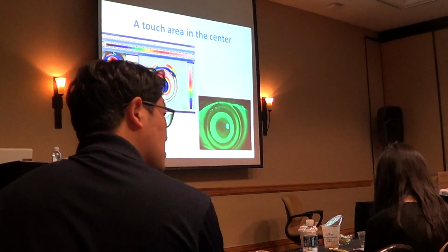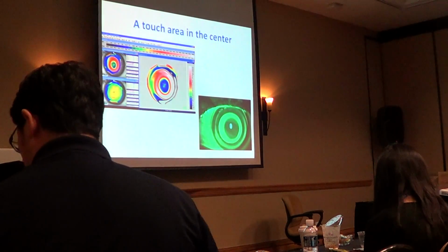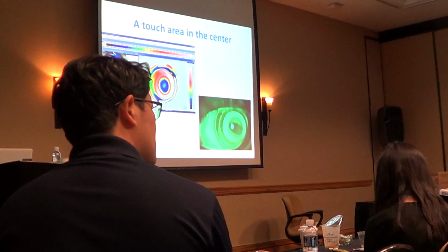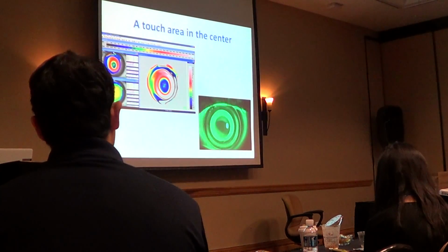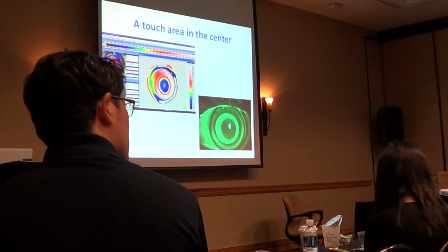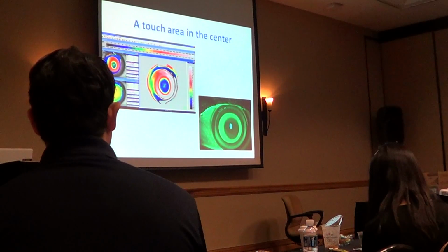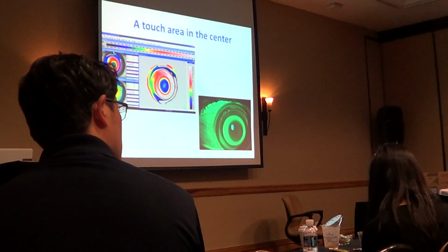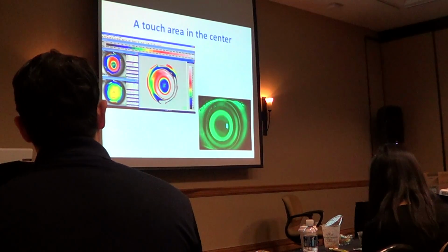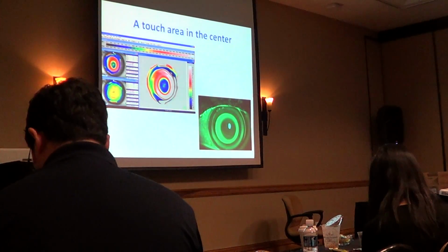Okay, if you have staining, you should change the lens. That's it. Because staining means risk of infection. If it's comfortable and there's no staining, you could leave the lens and wait. Sometimes things will get better. But you should be sure that you have a healthy cornea. Okay? That's very important. That's clear?